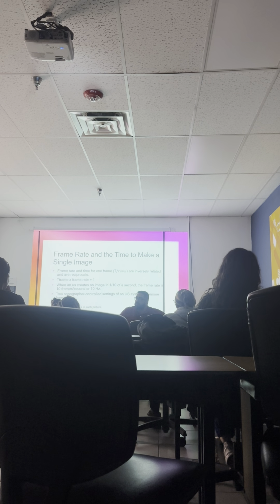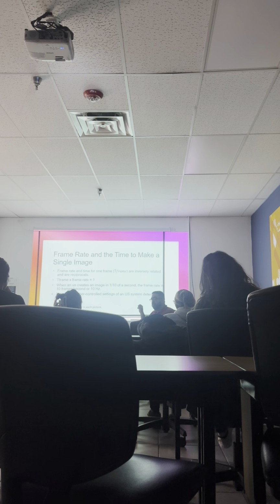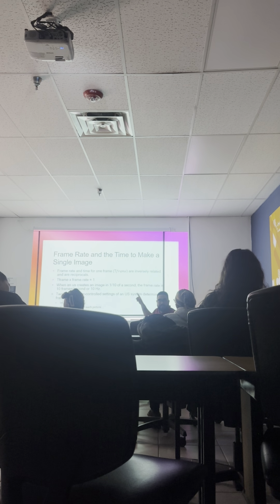Okay, so what relationship do T frame and frame rate have? They're inversely related, right? So frame rate is inversely related to depth, right? Yes. Okay, because frame rate and T frame have an inverse relationship. So if depth is inversely related to frame rate, it's going to be directly related to T frame.